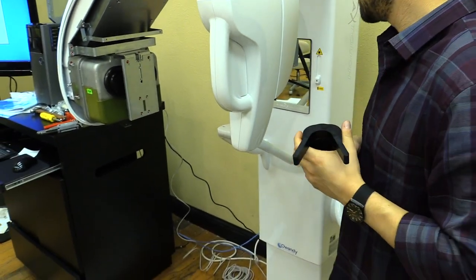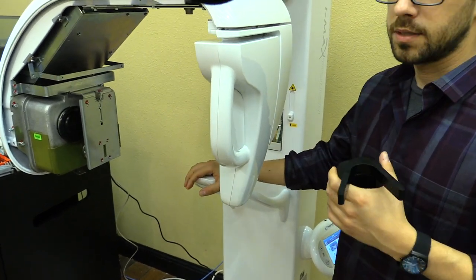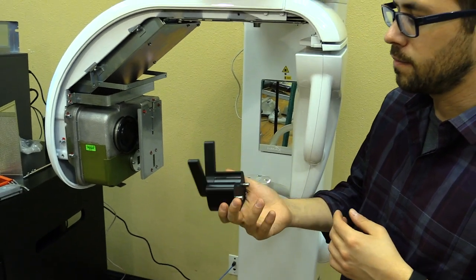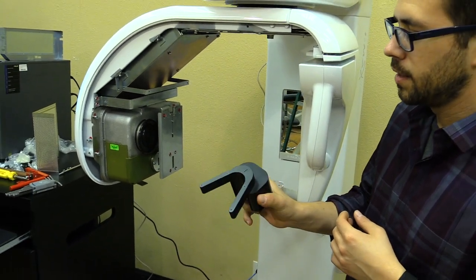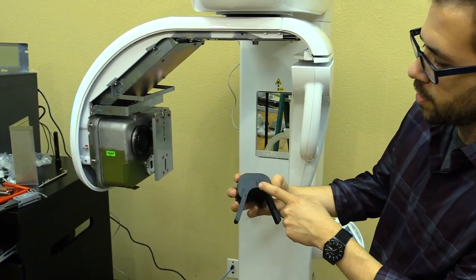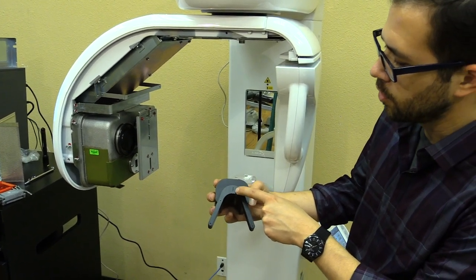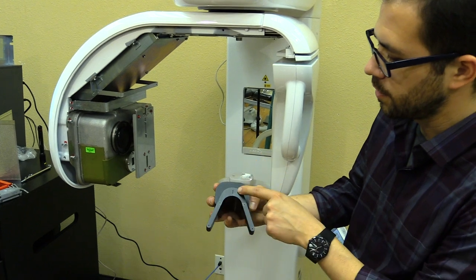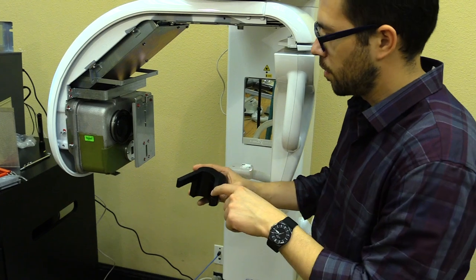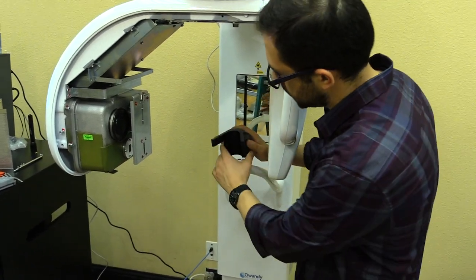We're going to align the x-ray beam and the rotation system with the chin rest. To do that we need our calibration tool — this is called the black phantom tool, and we use it to align the rotation system with the chin rest. There are three holes on the top of the phantom, each with a metallic ball at different heights, which we'll use later in the image. This arch is meant to mimic the arch of a patient, so it will be facing outwards when we position the tool.